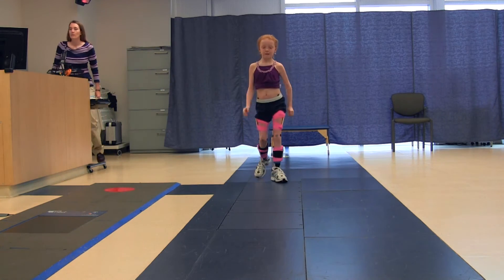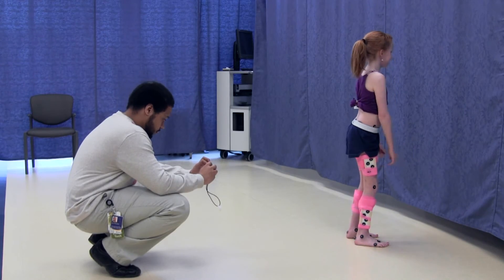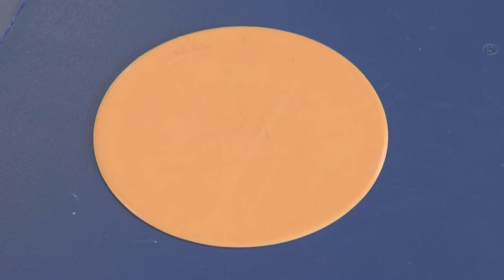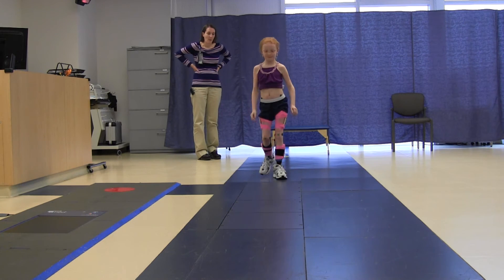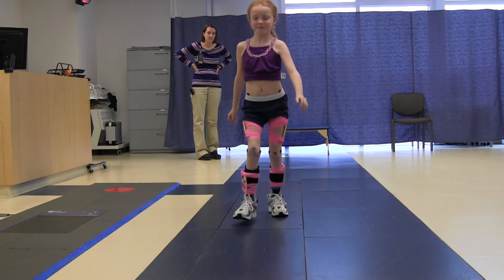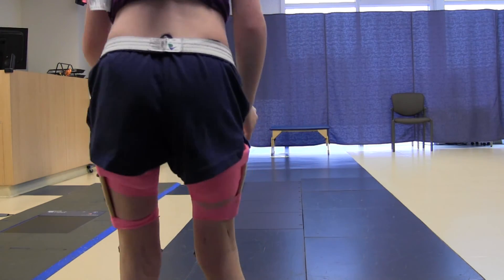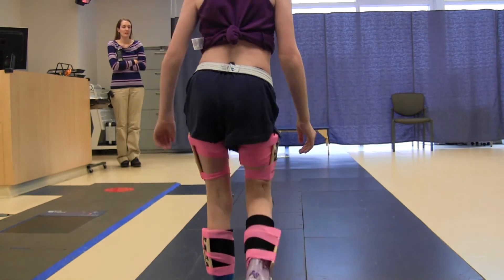I will walk back to the middle of the room on the blue line and stand still for 10 seconds. The lab assistant will take more pictures of my feet while I stand still. I will walk to a colored dot and stand until the lab assistant tells me to walk. I will walk down the blue line to the other colored dot like I did before, then stop and wait until I am asked to walk back. I will continue to walk back and forth until the lab assistant tells me that I am finished.